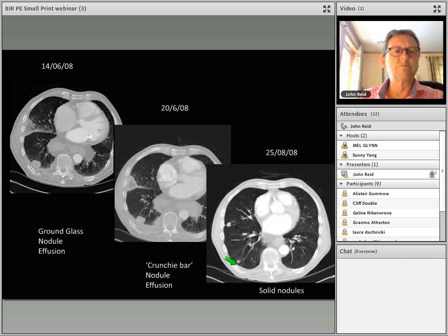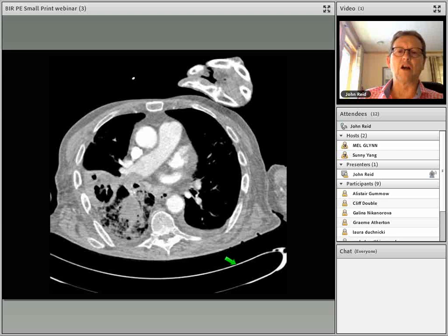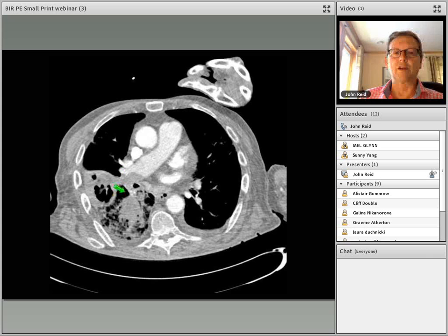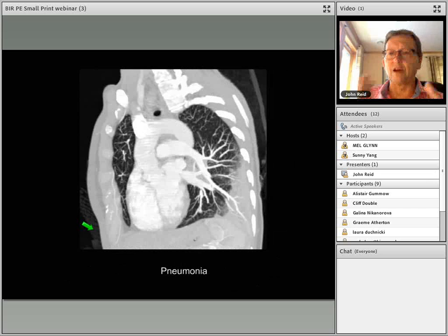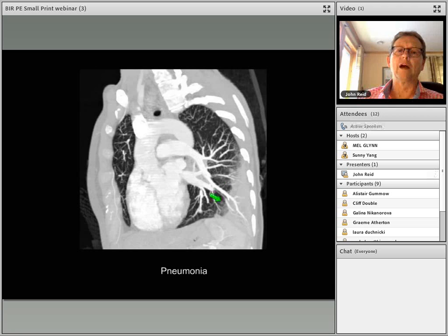Some pulmonary infarcts are particularly large and associated with necrotic lung. If the embolus is big enough, it can cause significant dead lung and subsequently develop an abscess. This is quite different from the appearance of pneumonia, which shows homogeneous, dense, pleural-based consolidation on the left side.